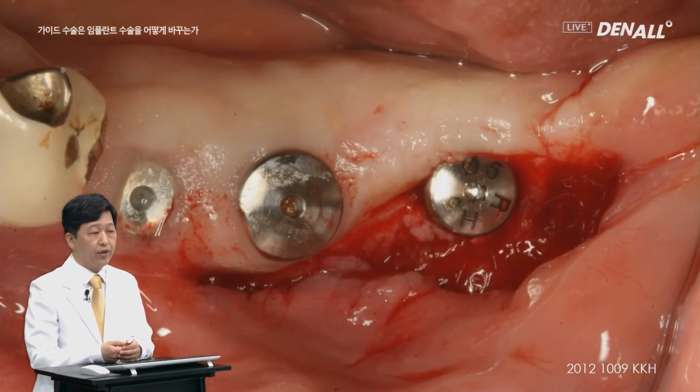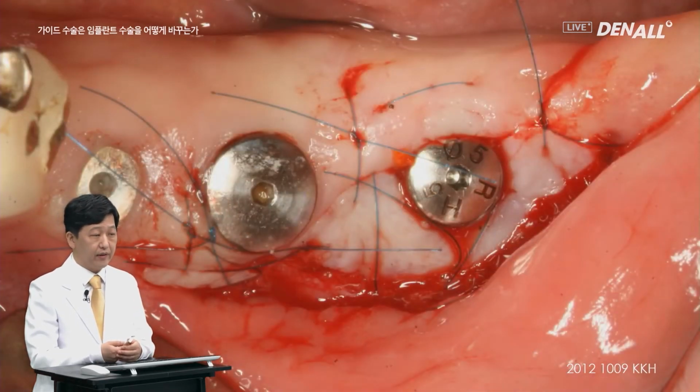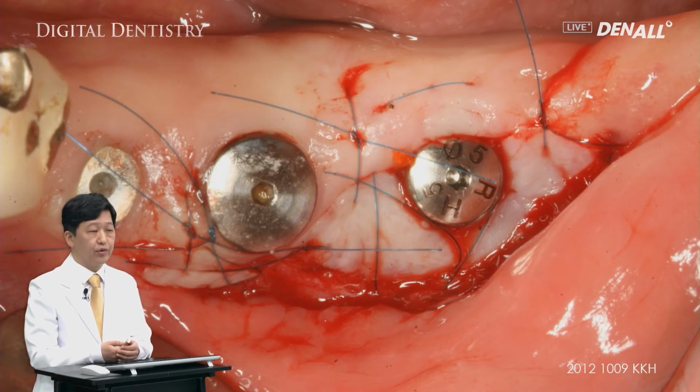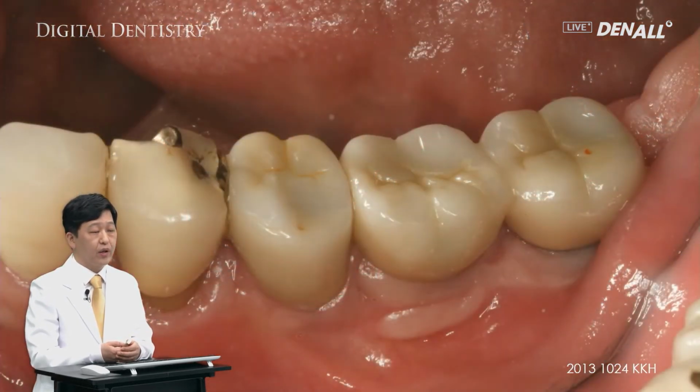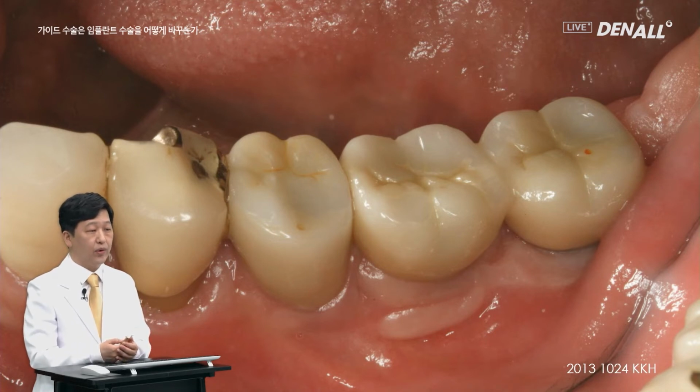Healing abutment was connected, bed was formed, and free gingival graft was done to create keratinized mucosa. Zirconia crown was used for the final prosthesis, and you can see keratinized tissue around the prosthesis. In these cases, when we use a guide, what changes in terms of soft tissue management?